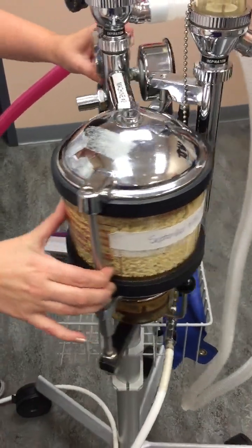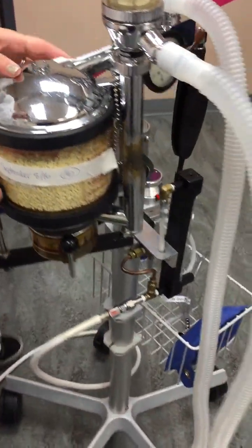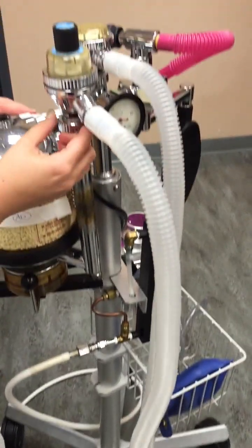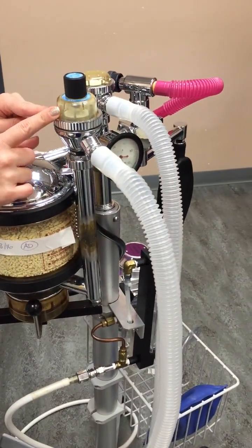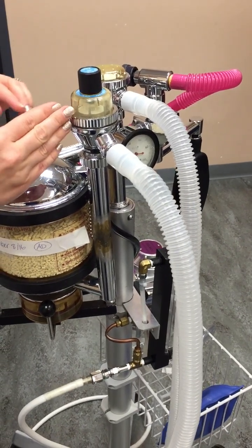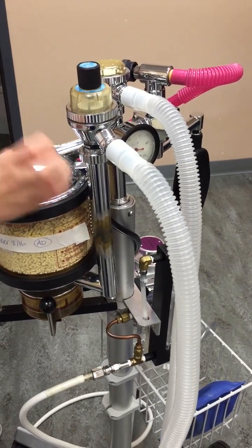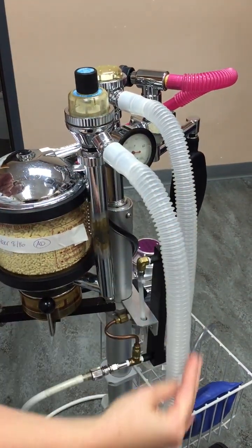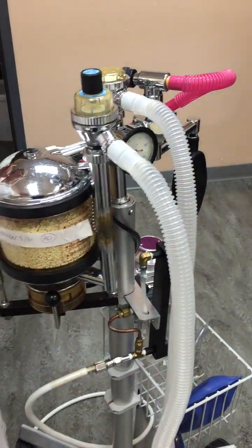So what happens is it will come out this tube, back up to the patient's inspiratory unidirectional valve, and any of the oxygen and isoflurane that wasn't used comes back to this limb and it goes back to the patient. So it's like a circle.